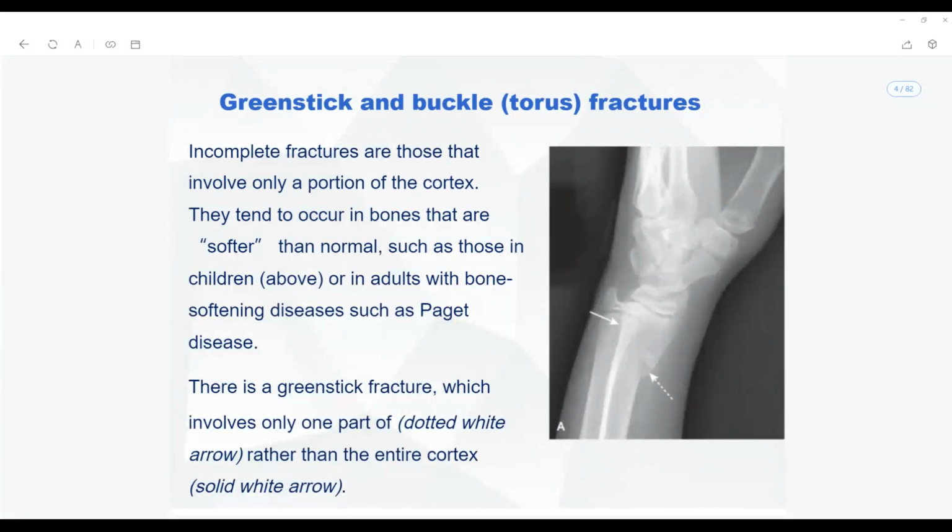Okay? We'll talk about the reason once again why we are doing this, because it is going to help us diagnose the conditions in a better way. Okay, rule number 4. When you are trying to look for the bones, make sure you include the epiphysis, the metaphysis, and the diaphysis at least one particular end.